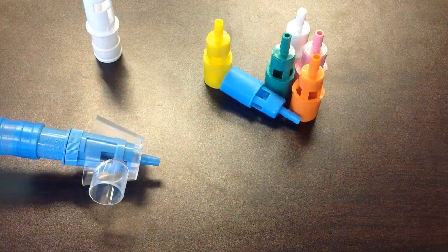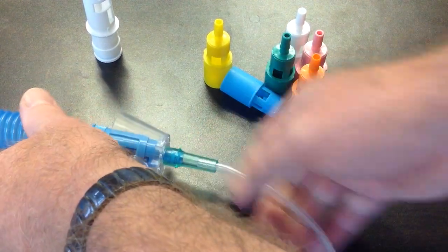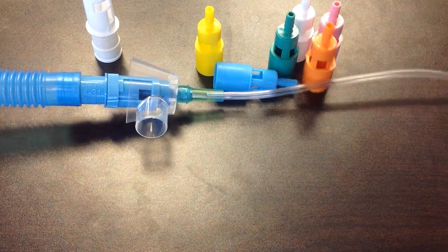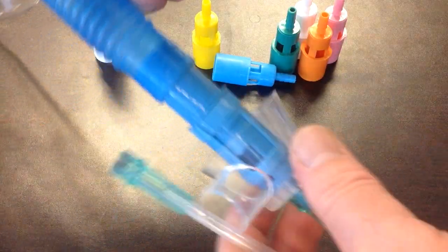And then here you take your oxygen tubing, hook it to this end, and the other end would get hooked to your flow meter.